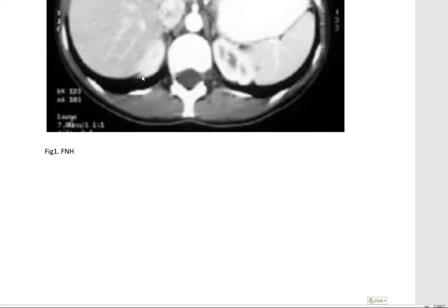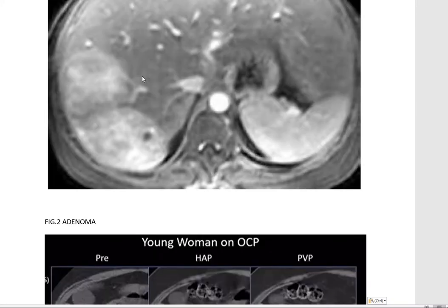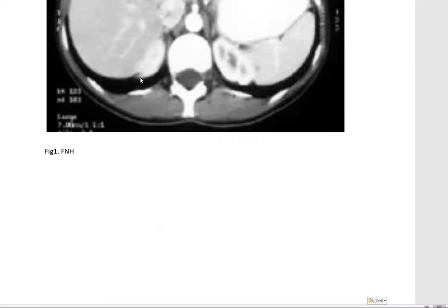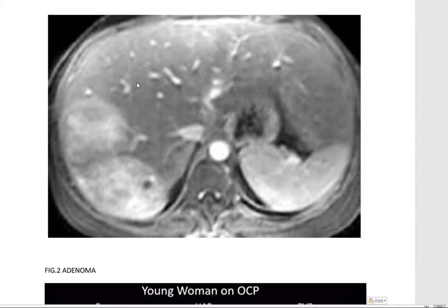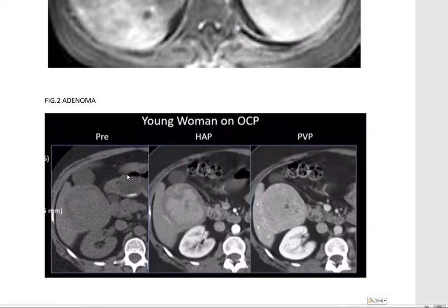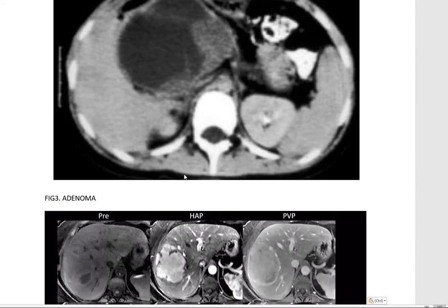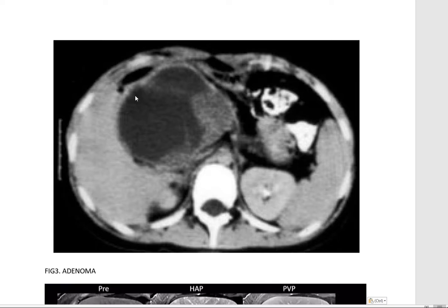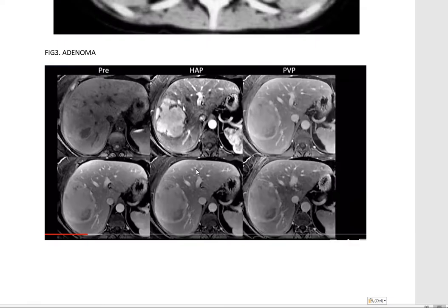Now let's look at adenoma. You can see the peripheral enhancement — not uniform enhancement. This is also adenoma in a young woman on OCP; you can see peripheral enhancement here. These are different phases — you don't need to know about those. Across these images: adenoma shows peripheral enhancement consistently.